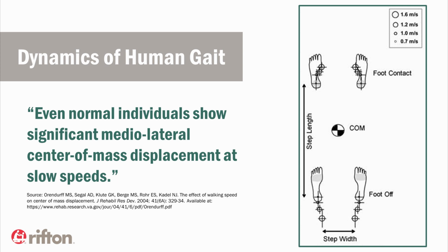Then as the walking speed increases, that lateral excursion decreases. So even with the same person, that lateral movement is varying during gait depending on their parameters of speed. So we want to accommodate that.